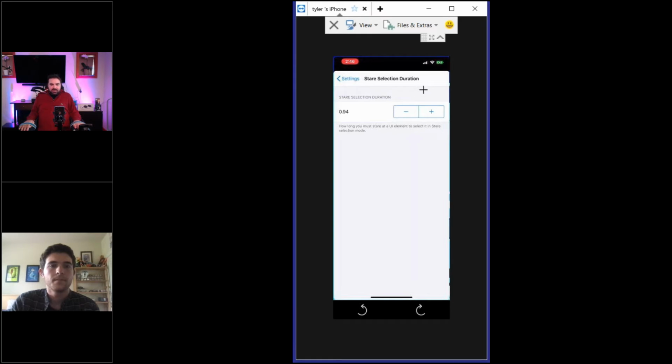And then you could always have your caretaker, whomever, help you with the settings rather than trying to do it yourself. How about positioning for these, Matt? So I've always wondered, let's say I don't have the phone positioned right in front of my face. If I put it at an angle, would it essentially do the same thing? Or any thoughts on just getting it in the right spot?